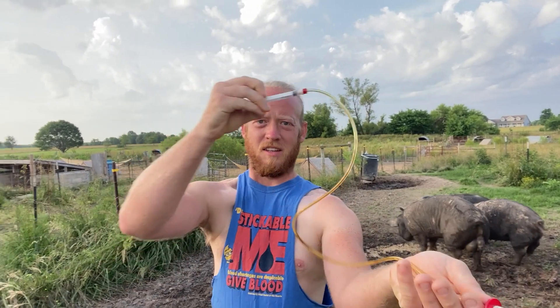You see that she ran away and all I had to do is keep this somewhat close and the needle will stay in. Whereas if you're just trying to stab her and stay exactly on her the entire time, it's not very effective.